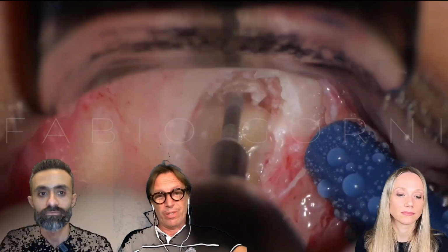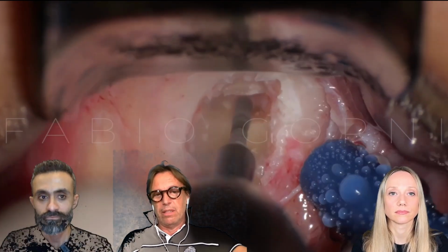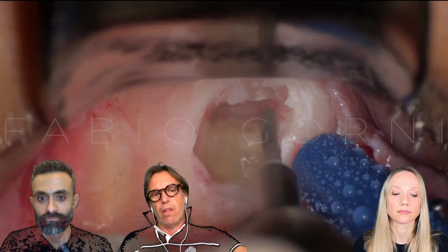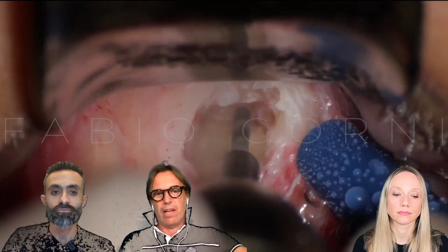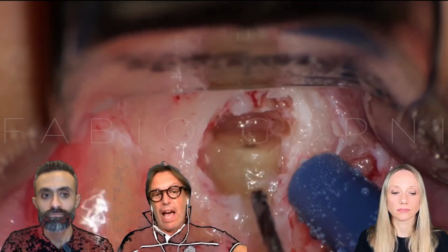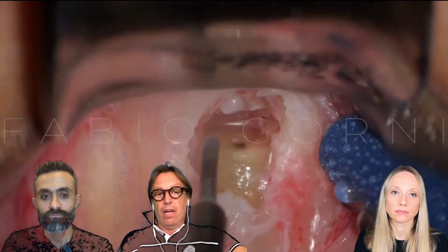And it's so important to follow the action of our burrs, especially in the back, if you want to cut the root completely, for example in the lower molar, where sometimes we are very close to the lingual cortical plate. So that's why I cannot understand why some people are using the angulated handpiece. It is absolutely not logical.